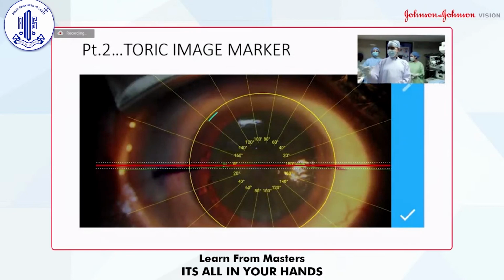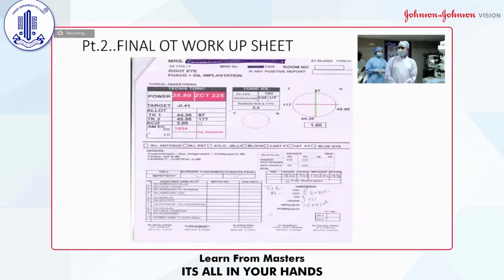So this is the same picture which I was telling of the same patient we have taken. So you can see that on a left upper corner there is a blue line, ocean blue line. So there is a place of incision, and you can see the other side there is an axis which is marked. Next. So we can now mark 90 degree on both.